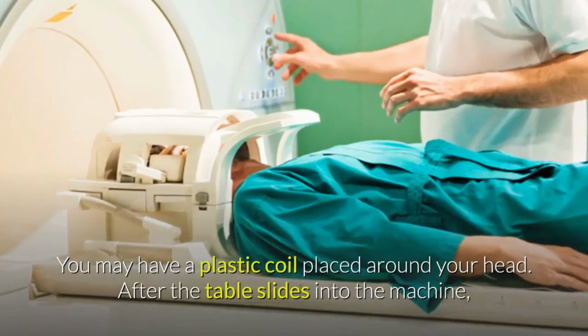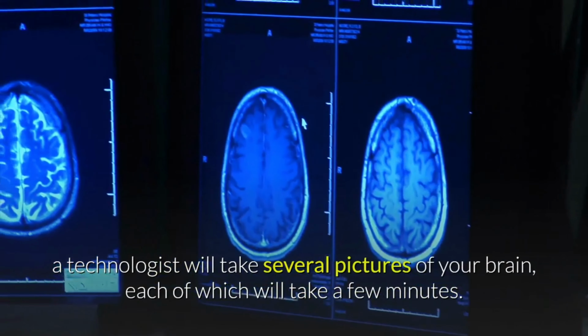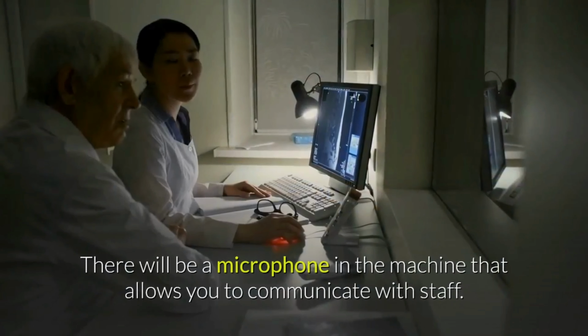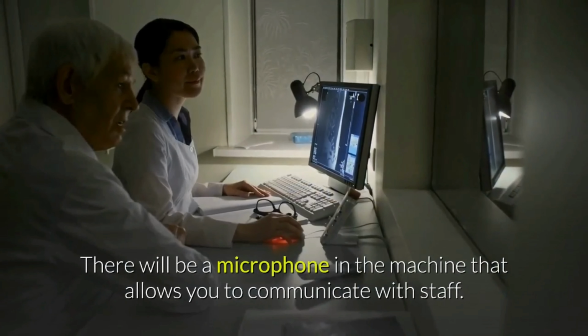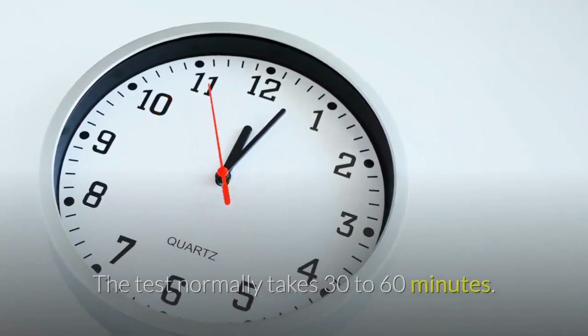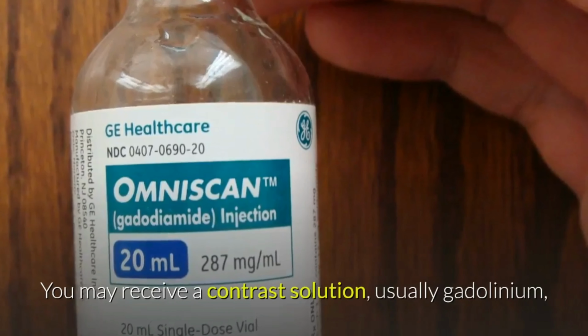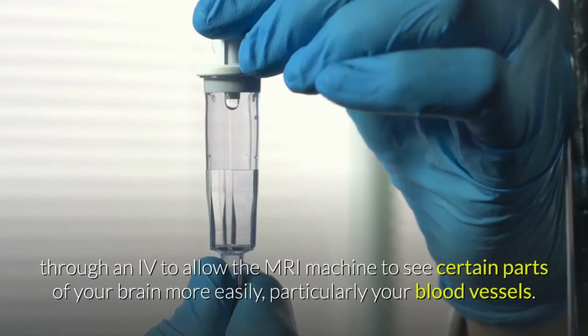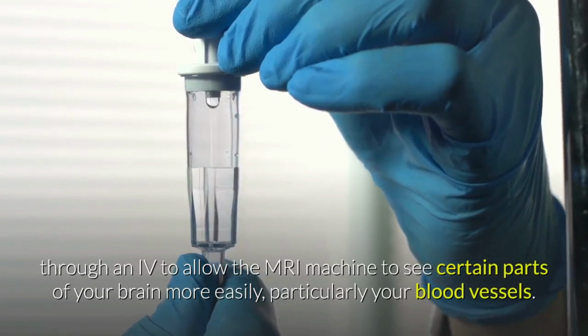After the table slides into the machine, a technologist will take several pictures of your brain, each of which will take a few minutes. There will be a microphone in the machine that allows you to communicate with staff. The test normally takes 30 to 60 minutes. You may receive a contrast solution, usually gadolinium, through an IV to allow the MRI machine to see certain parts of your brain more easily, particularly your blood vessels.